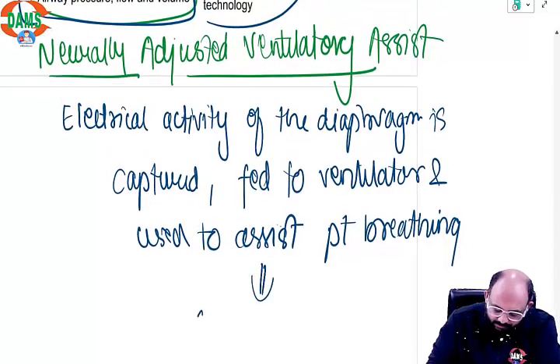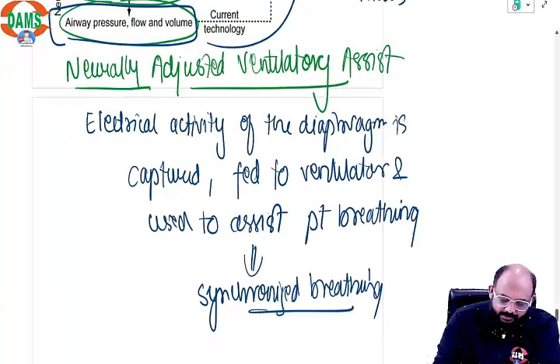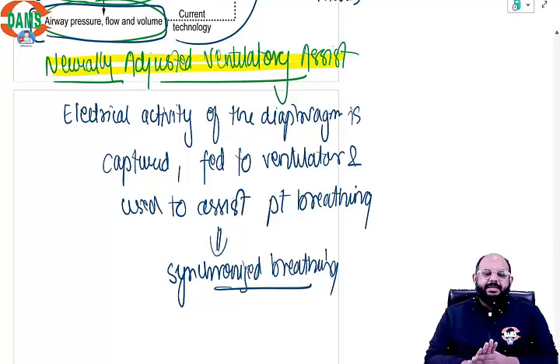This causes synchronized breathing. This is NAVA, neurally adjusted ventilator assist.